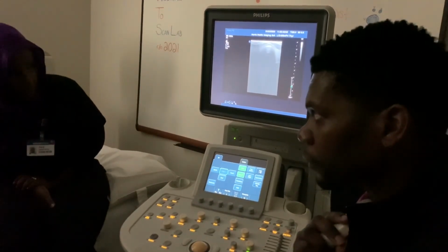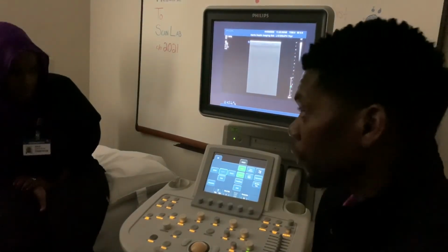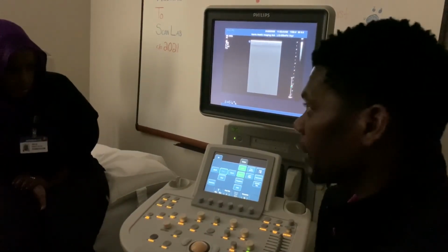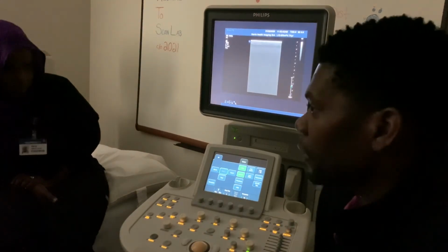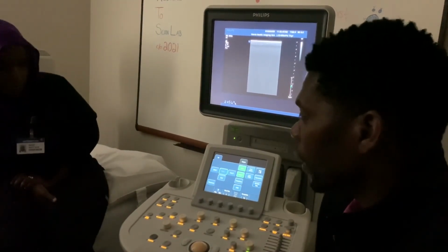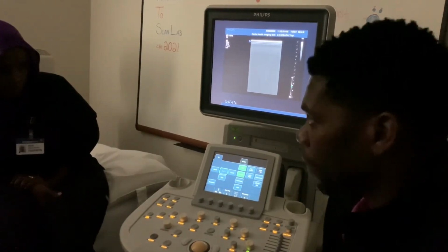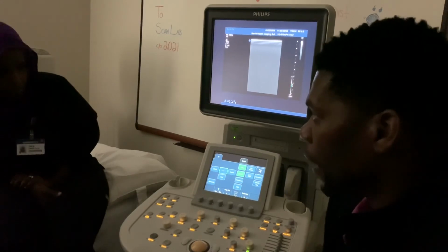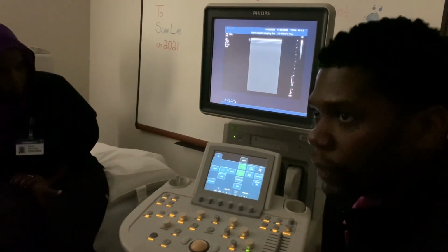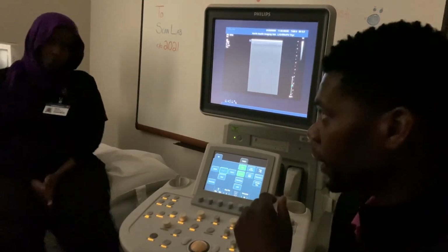Okay. So we don't use this, just when we learn in the class. Right, but when you answer on the test, and I ask you, say this image is really bright overall, what should I do first? Your answer will be turn down or decrease my acoustic power, decrease my output power, decrease my transducer output. Okay? So I just wanted to show you guys where that button is.